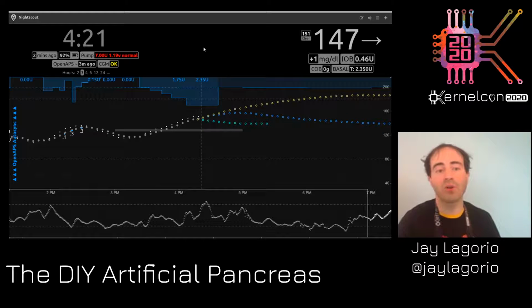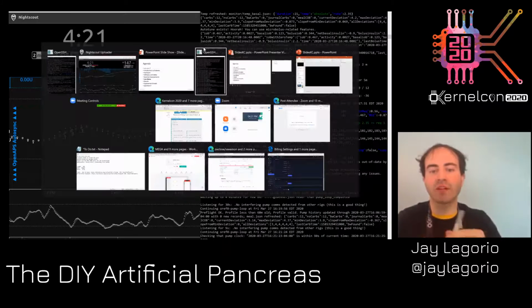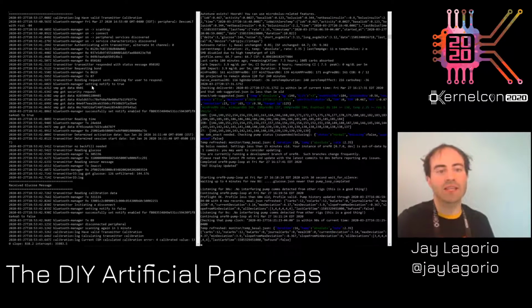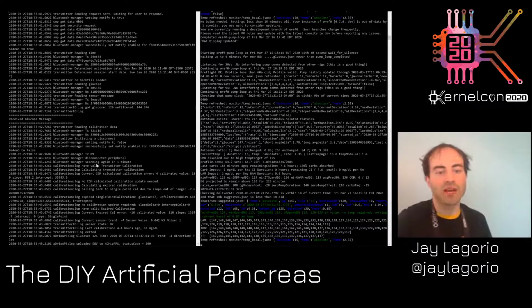So there's our failure mode implemented right there. And the other thing that I wanted to show are logs from the system running in real time. This one is not in real time because it's not easily predictable. But this is the service that does your blood glucose readings, syncing with Nightscout, and then waiting for a Bluetooth connection. And then this is it chattering back and forth, getting the sensor data and information about the session, and then using it to calibrate everything.